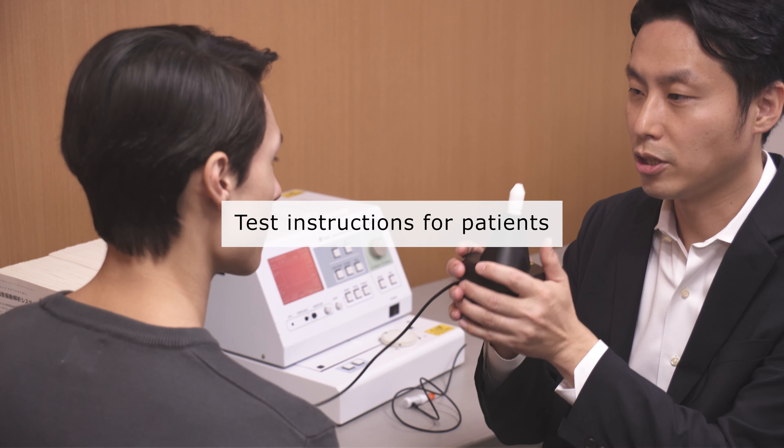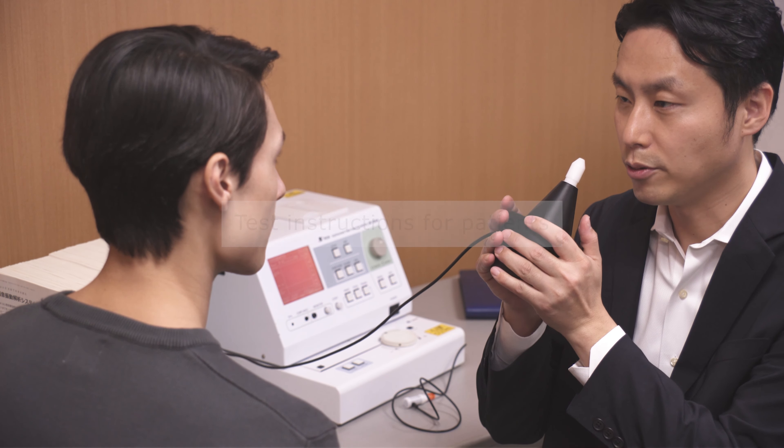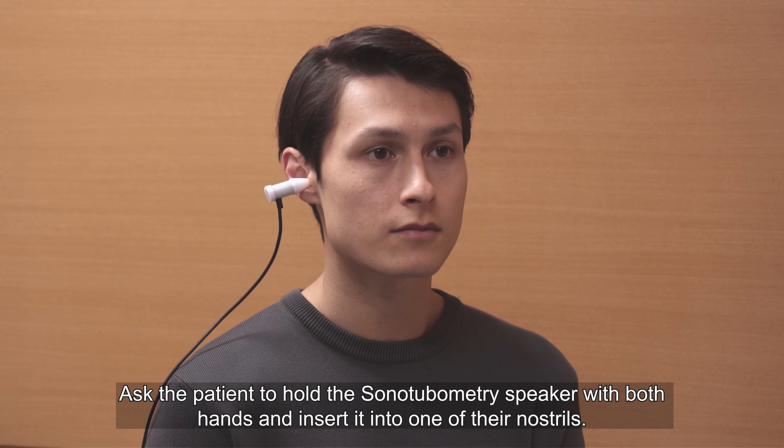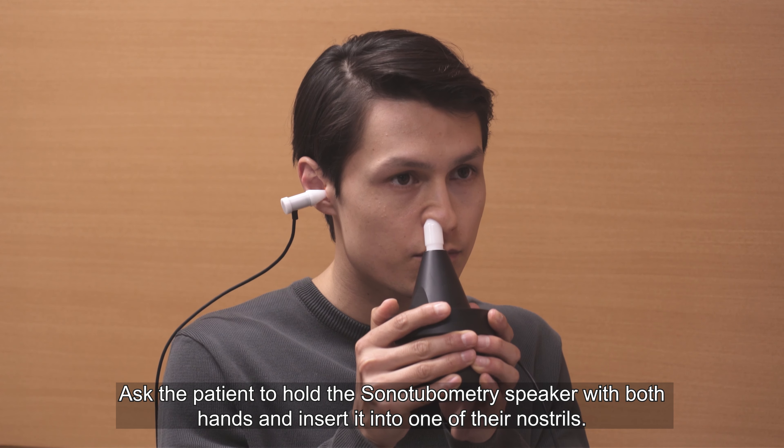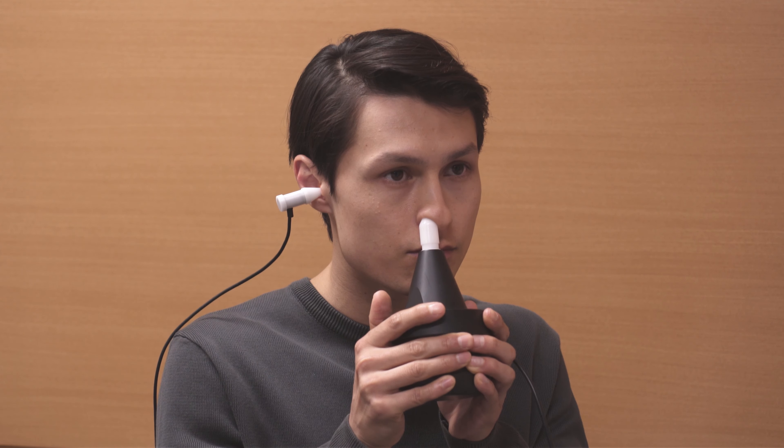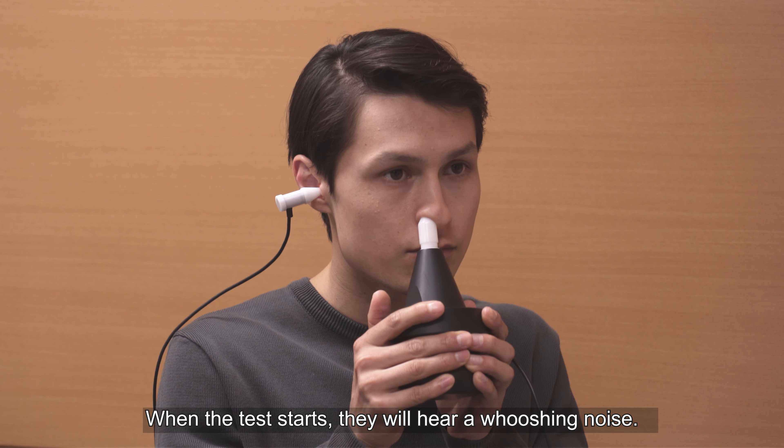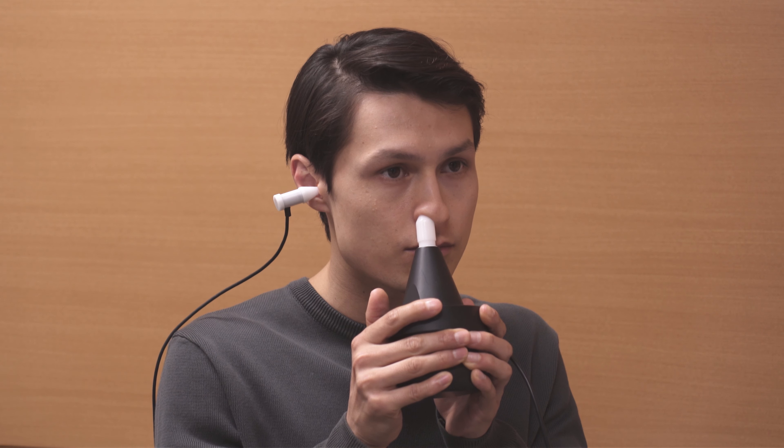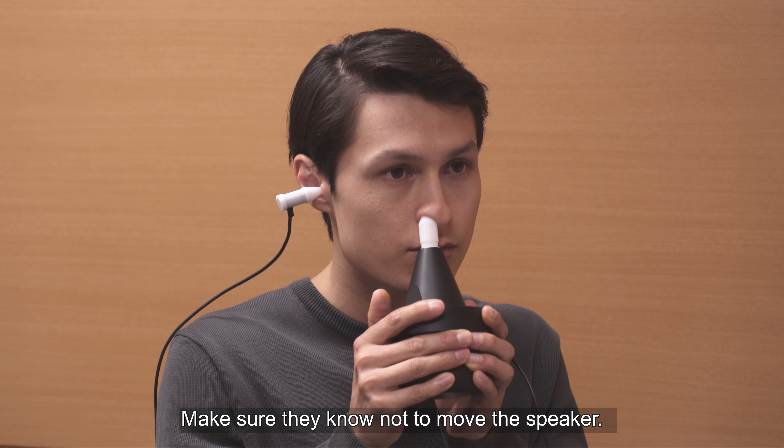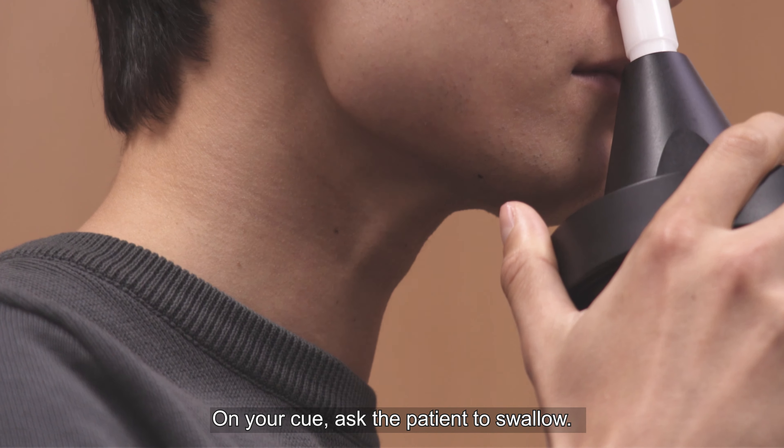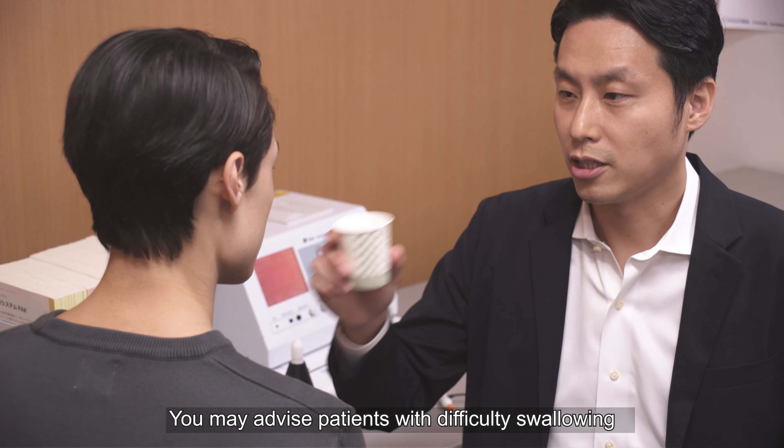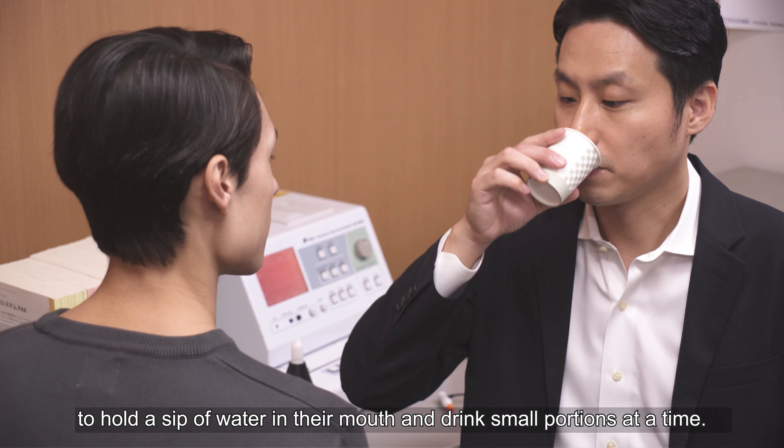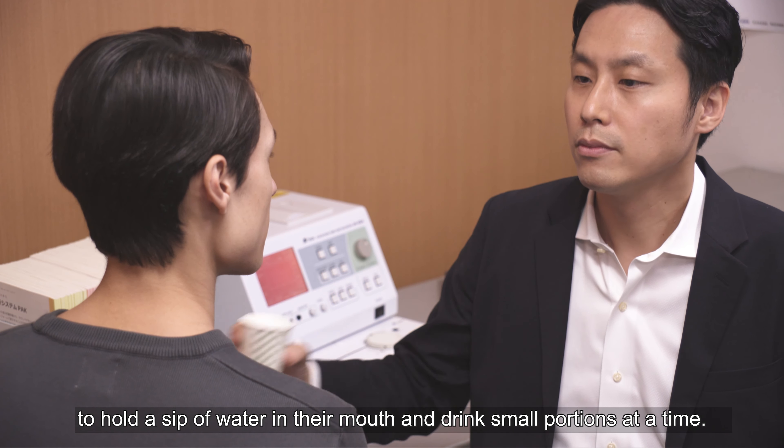Provide the following instructions to your patient during the test. Ask the patient to hold the sonotubometry speaker with both hands and insert it into one of their nostrils. When the test starts, they will hear a whooshing noise. Make sure they know not to move the speaker. On your cue, ask the patient to swallow. You may advise patients with difficulty swallowing to hold a sip of water in their mouth and drink small portions at a time.